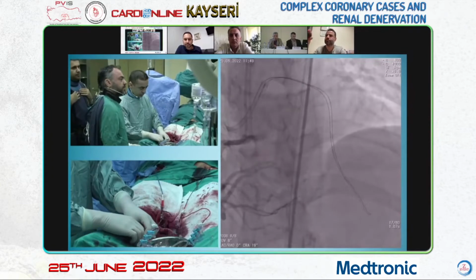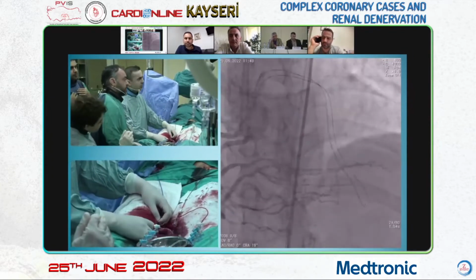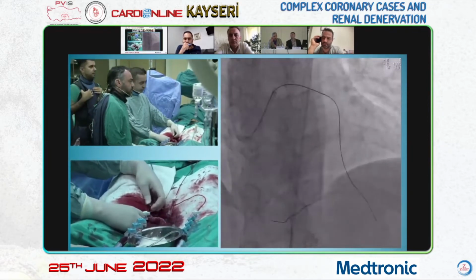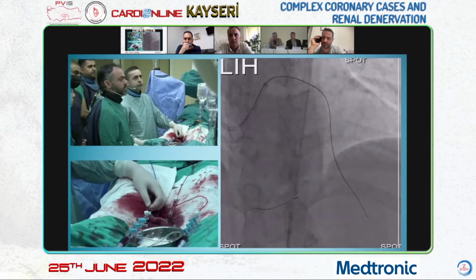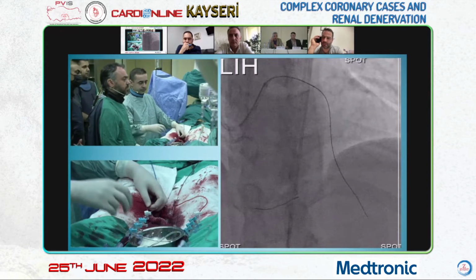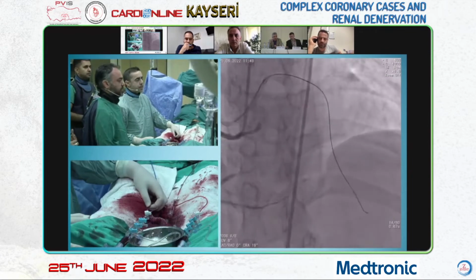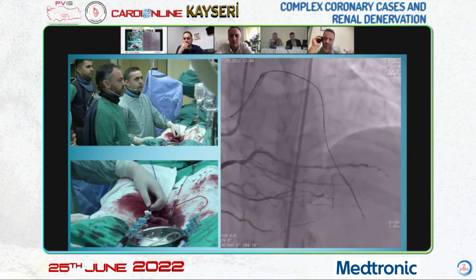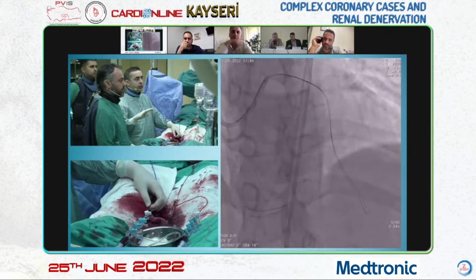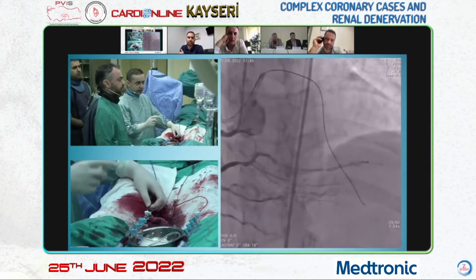What Korhan said is important. Sometimes in calcific lesions and in angled bends, we see it, especially using composite core or Gaia wires. After a certain stage, the lesion squeezes the wire. It becomes difficult to go to the distal. So a polymer covered wire is easily taken to the distal, and moving with a microcatheter becomes easier. And you need to check it from a reverse position.